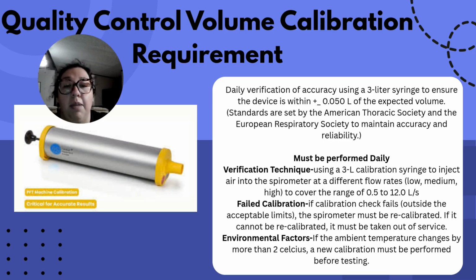Environmental factors. If the ambient temperature changes by more than 2 Celsius, a new calibration must be performed before testing. And all these are done to ensure that you have the correct and most reliable results to be able to assess and diagnose your patient as accurately as possible.